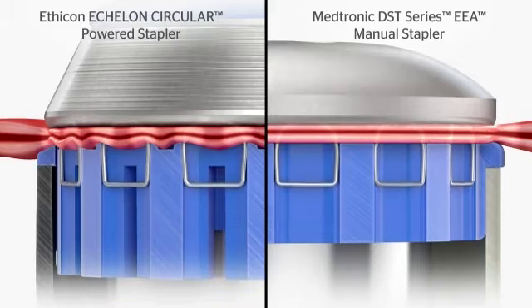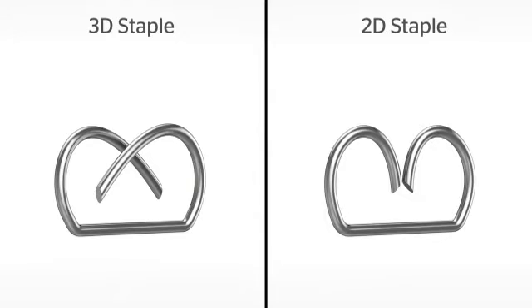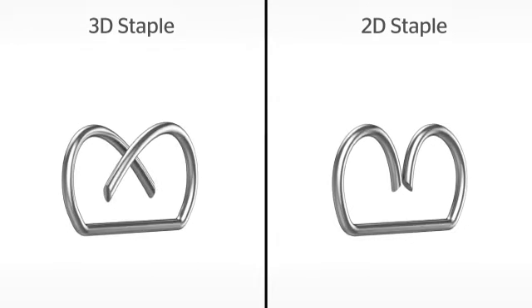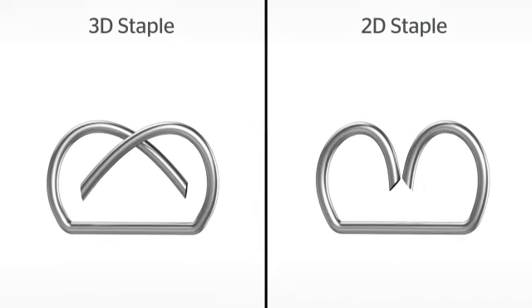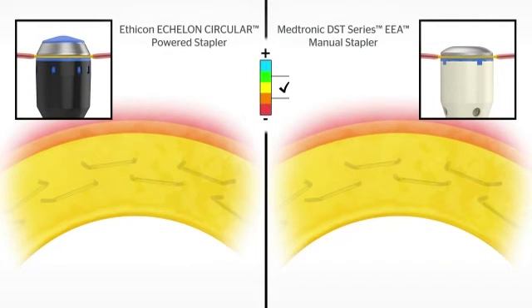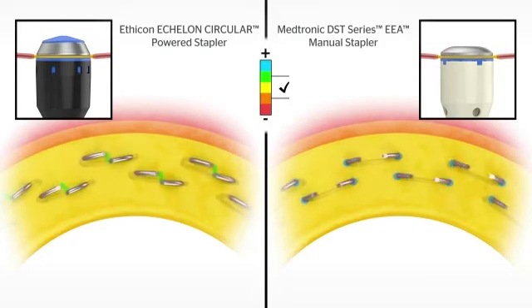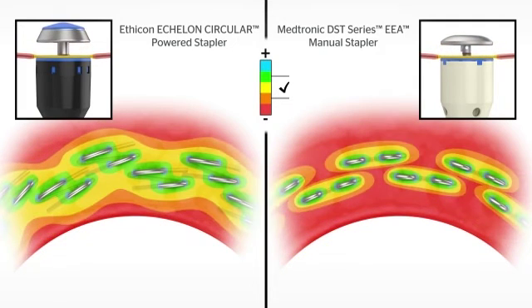The Echelon Circular powered stapler also features 3D stapling technology. The 3D staple is designed with offset closure of the staple legs to evenly distribute compression throughout the staple line. As the anvil closes down, it compresses the tissue layers. The colored scale demonstrates the level of compression: pink has no compression and blue has the highest compression, with the ideal compression at the middle of the scale. 3D stapling technology evenly distributes compression and reduces potential leak paths.